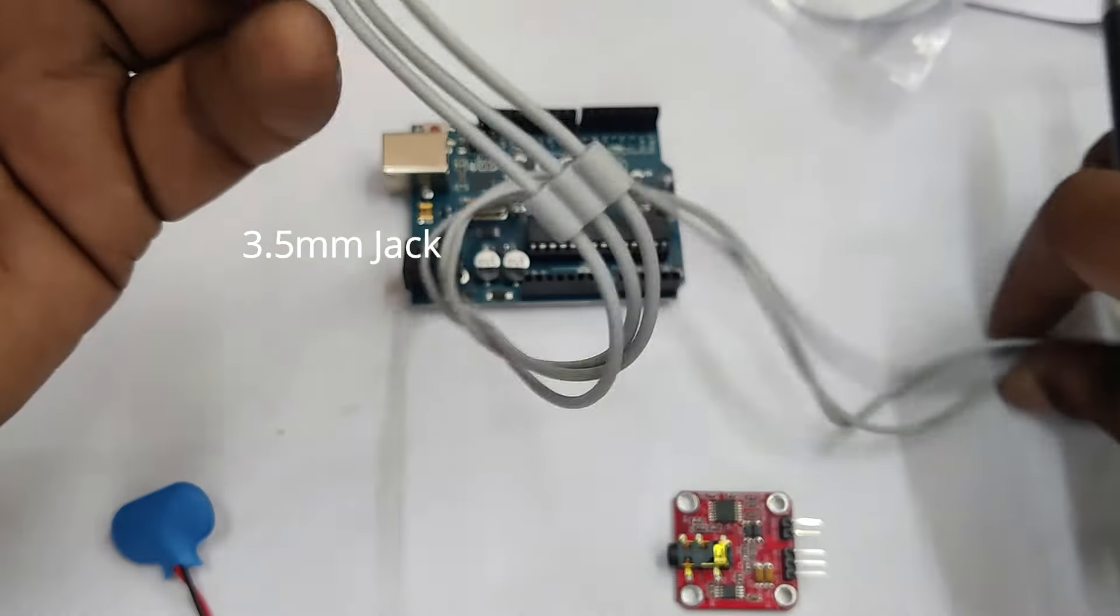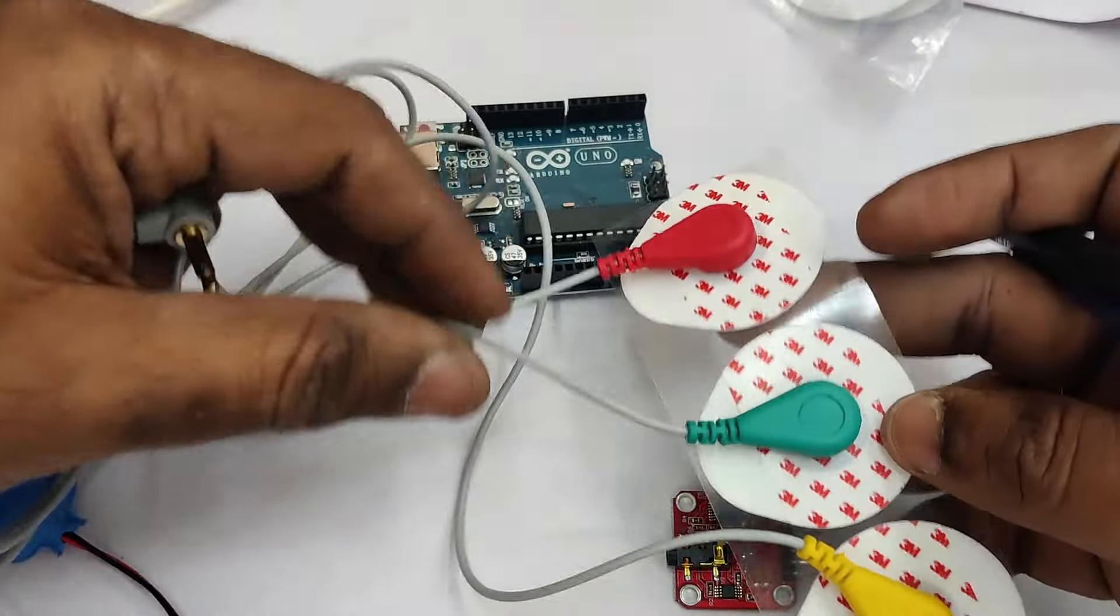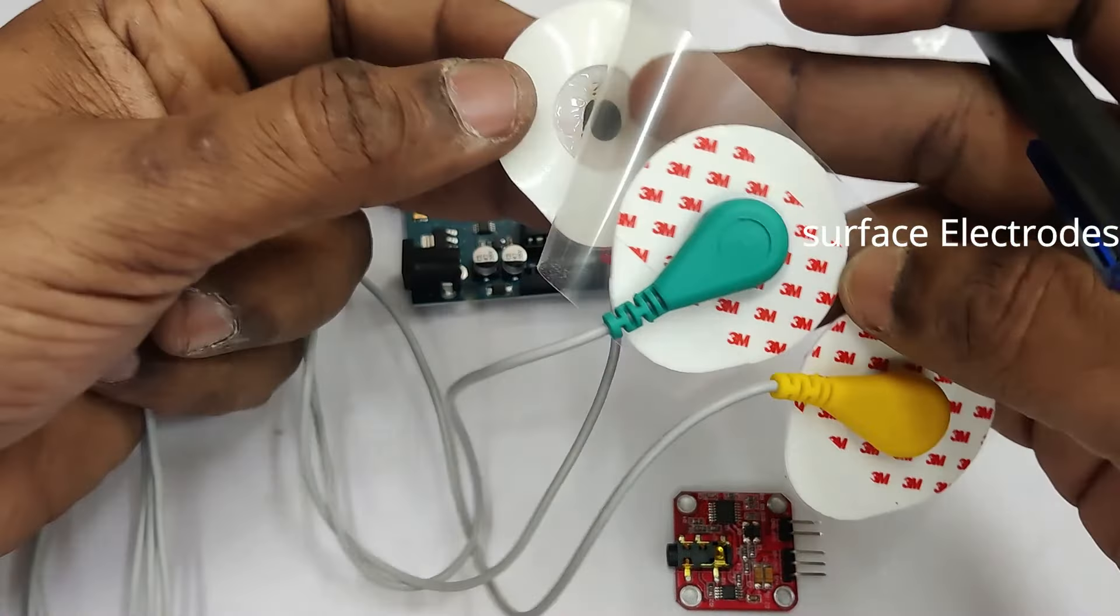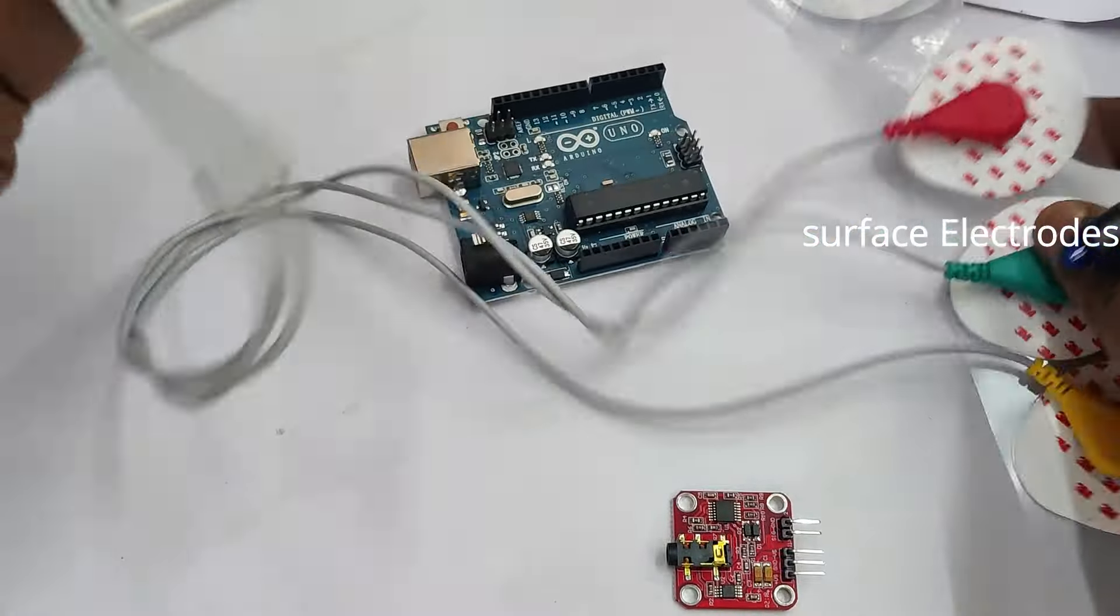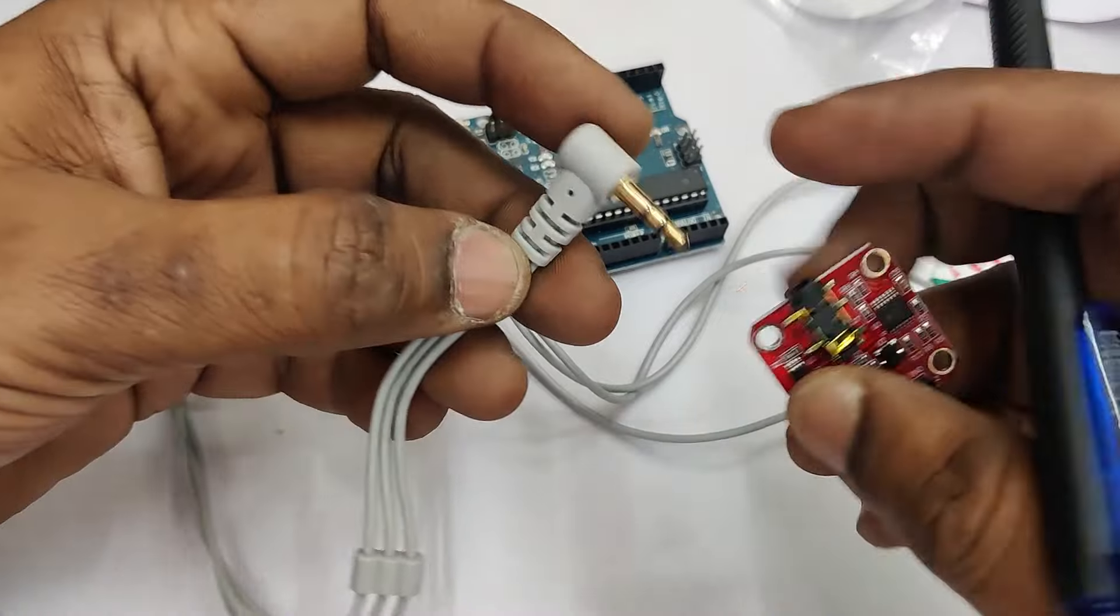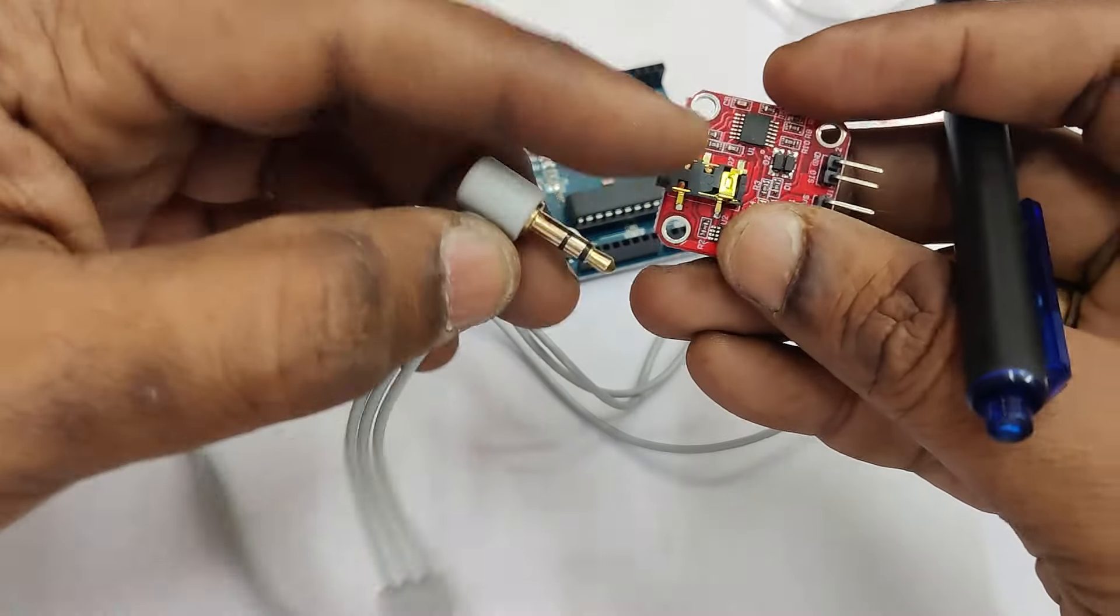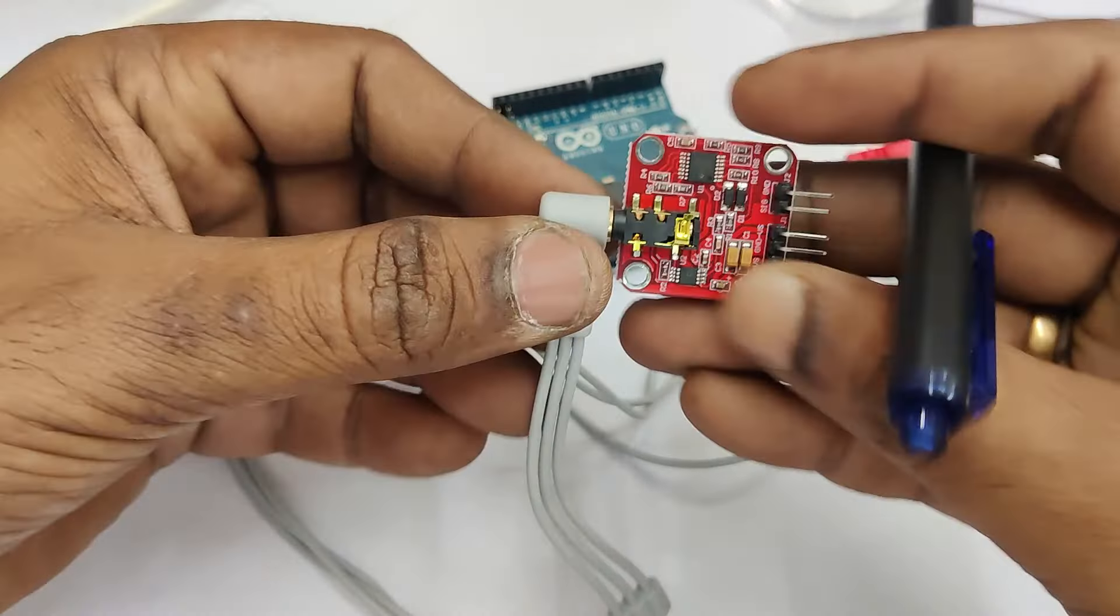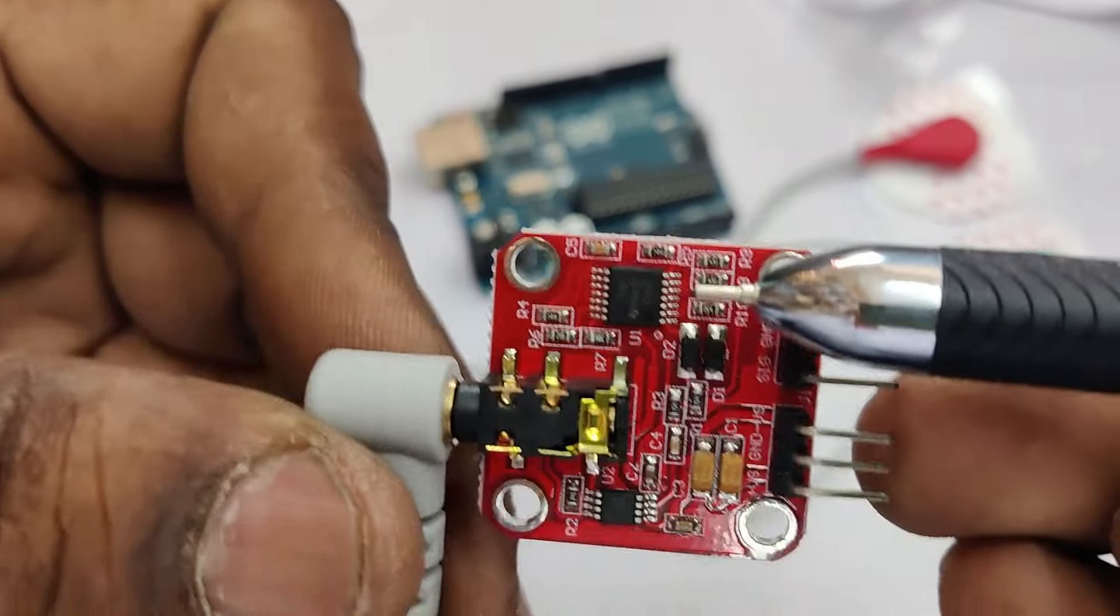It has got a red amplifier board and a 3.5mm jack. The other end of 3.5mm jack is connected with three electrodes. These are all surface electrodes for transmitting the electrical signals generated by the muscle movement.